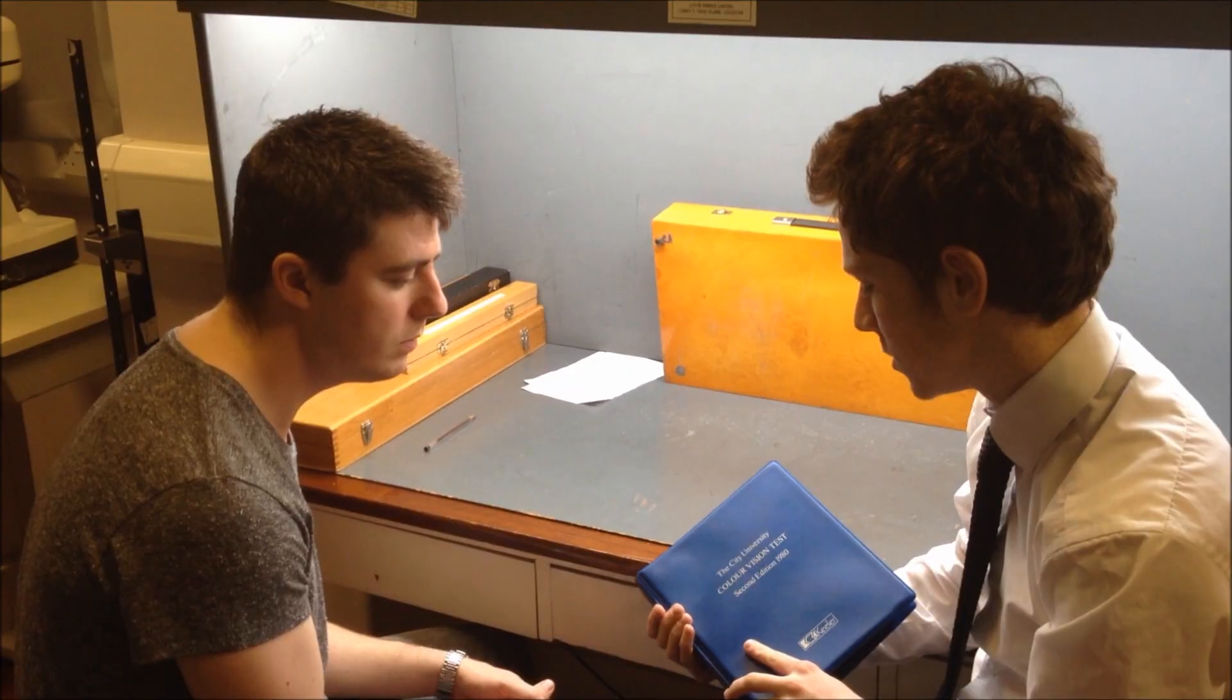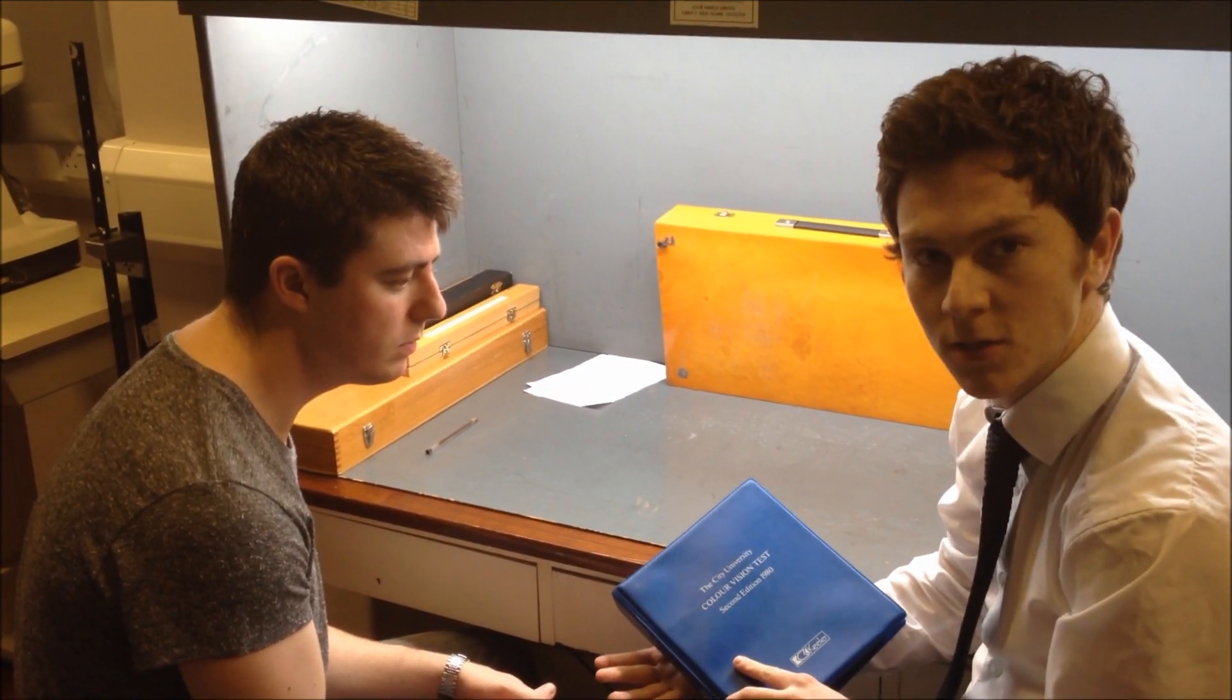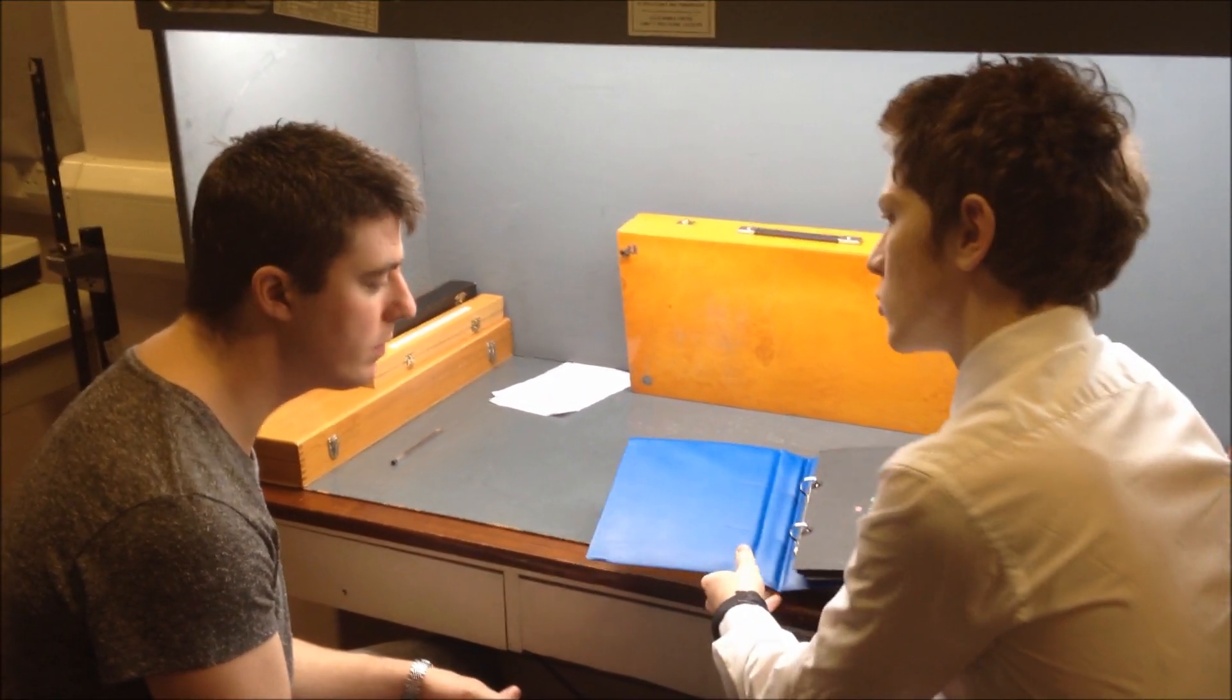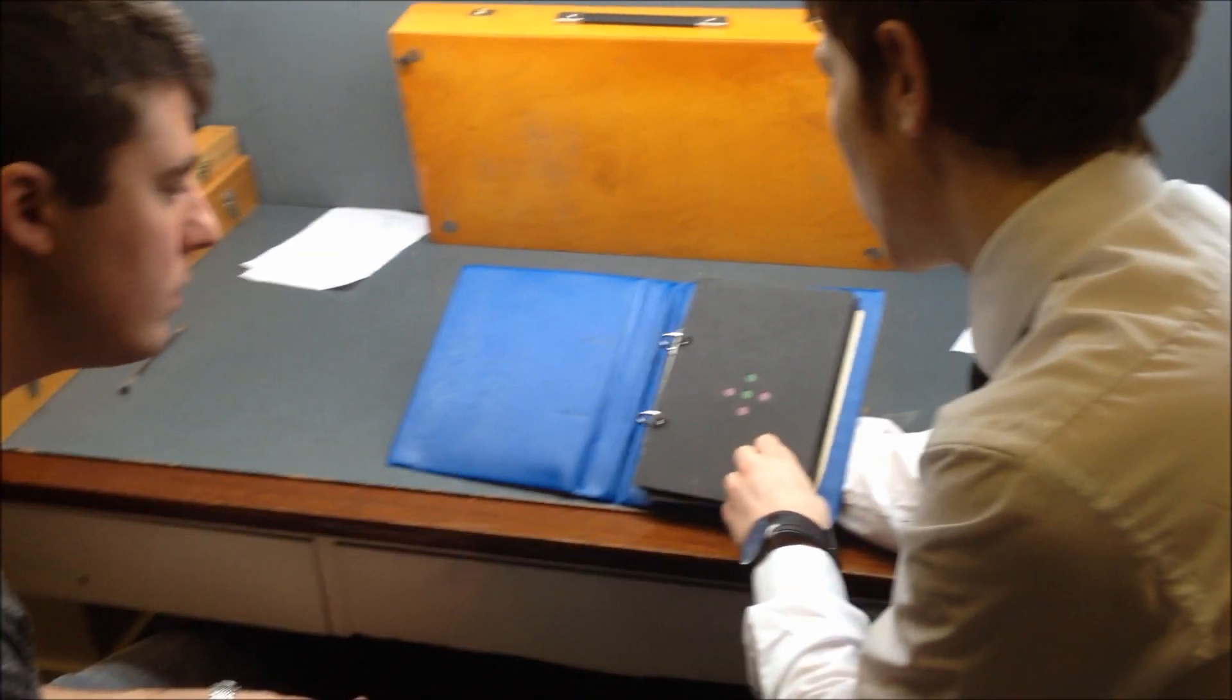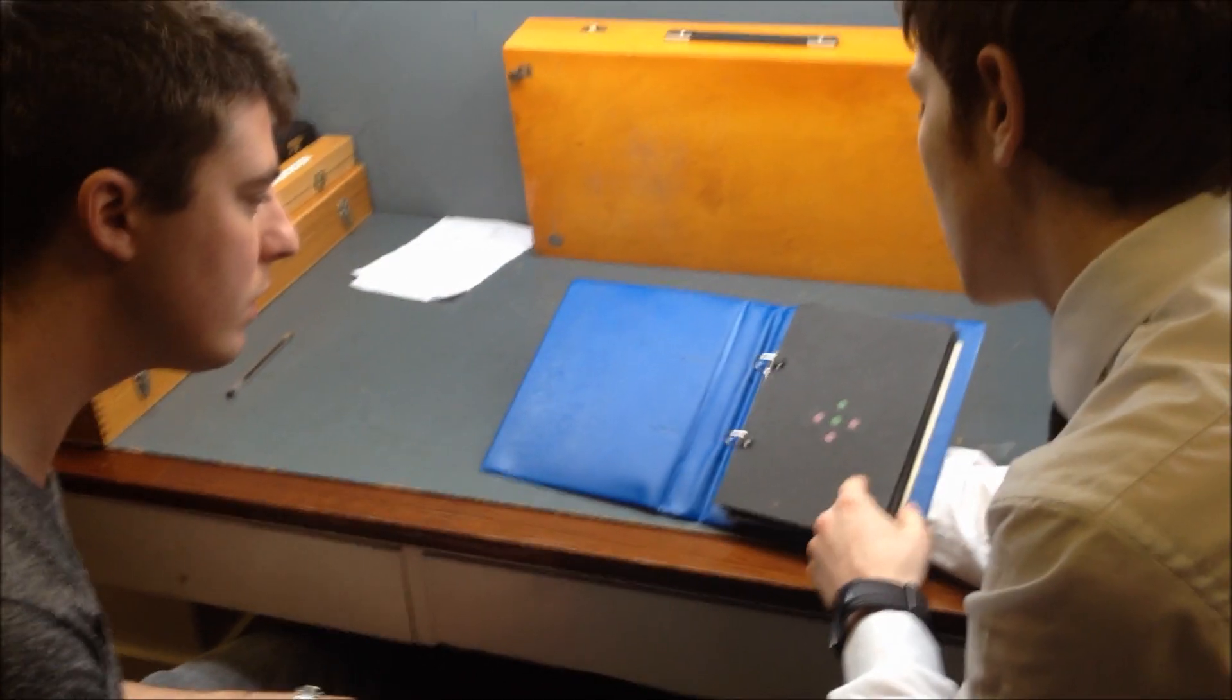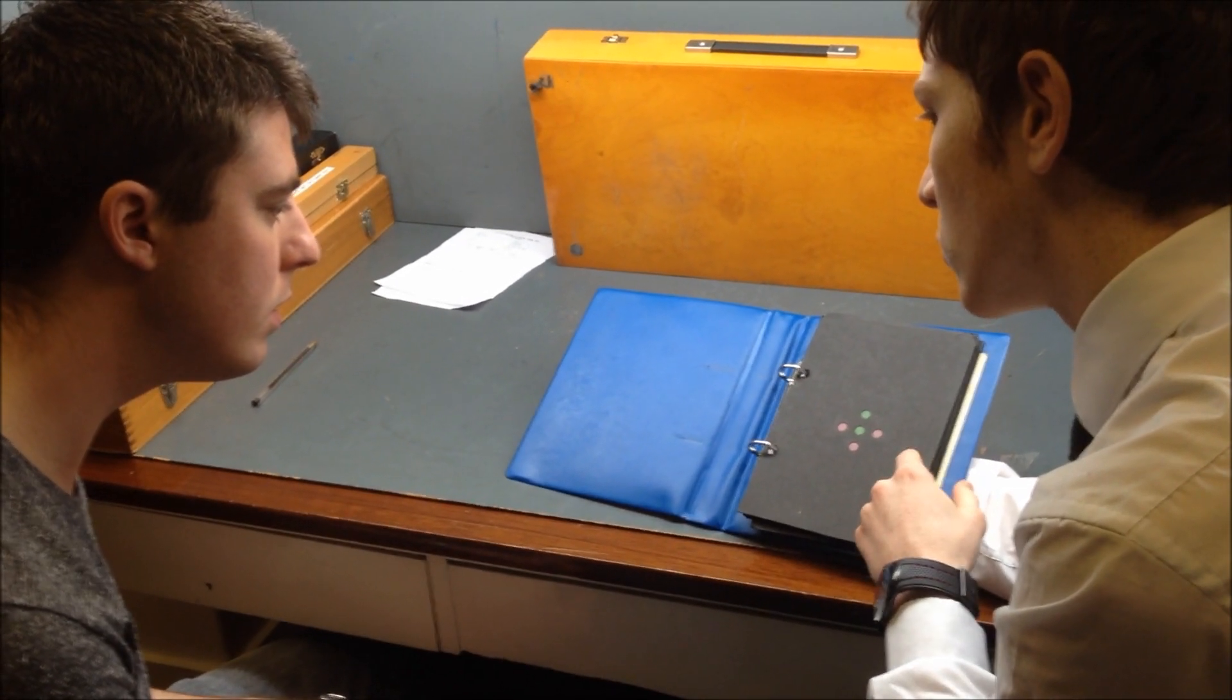Thomas is now going to do the City University color vision test with us today. So what I'm going to ask you to do is, you'll see the four colors around the one in the middle. So without touching, I want you to tell me which color in the periphery is closest to the one in the middle.